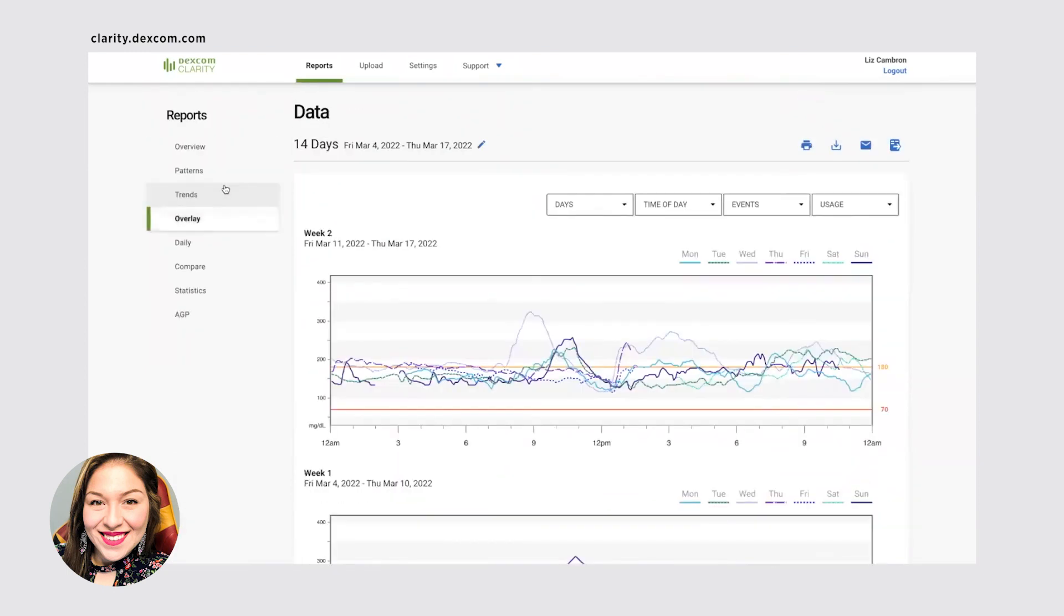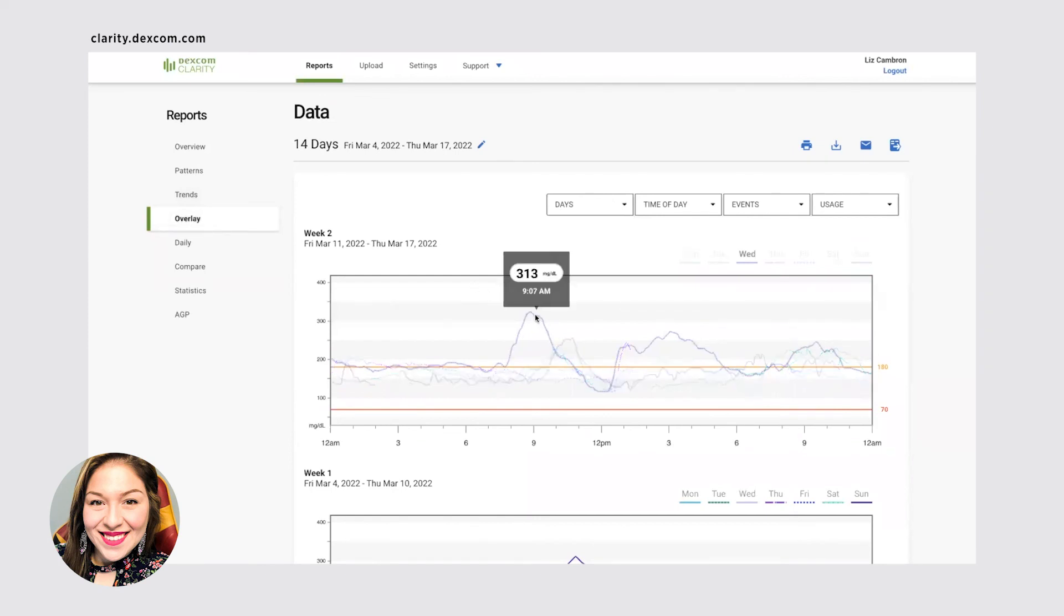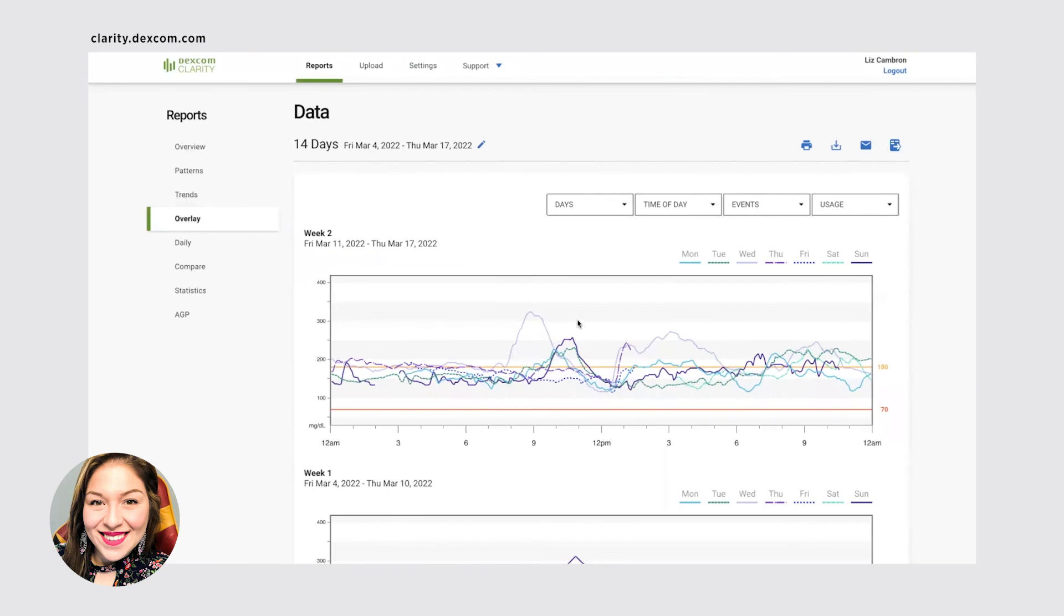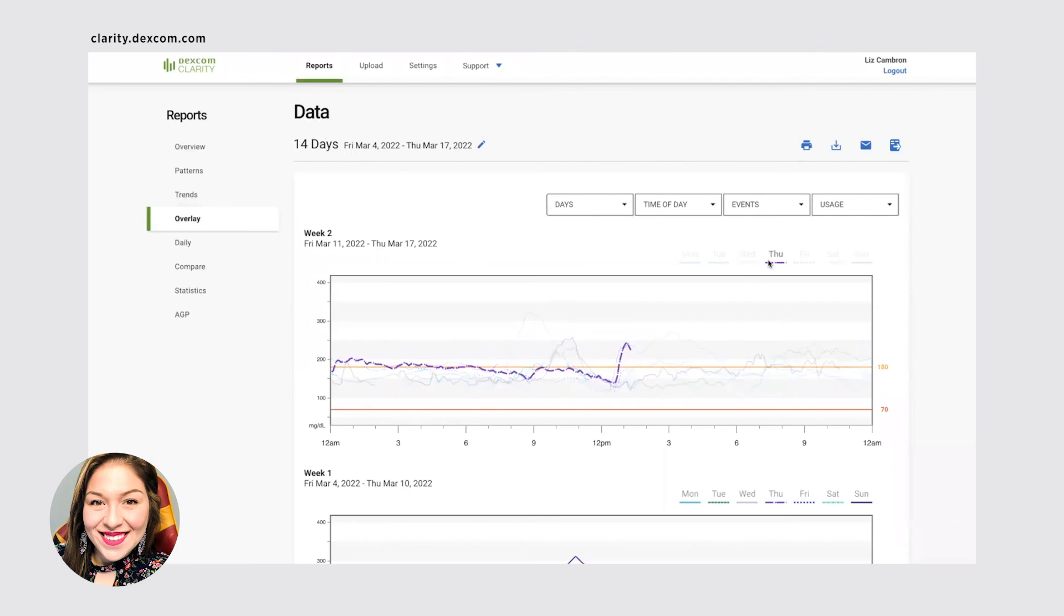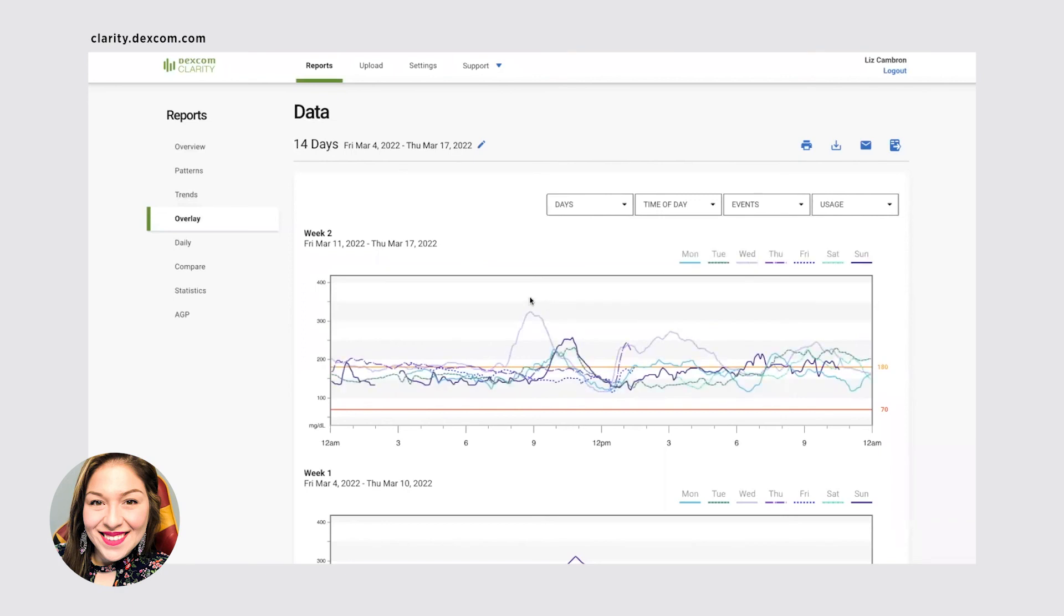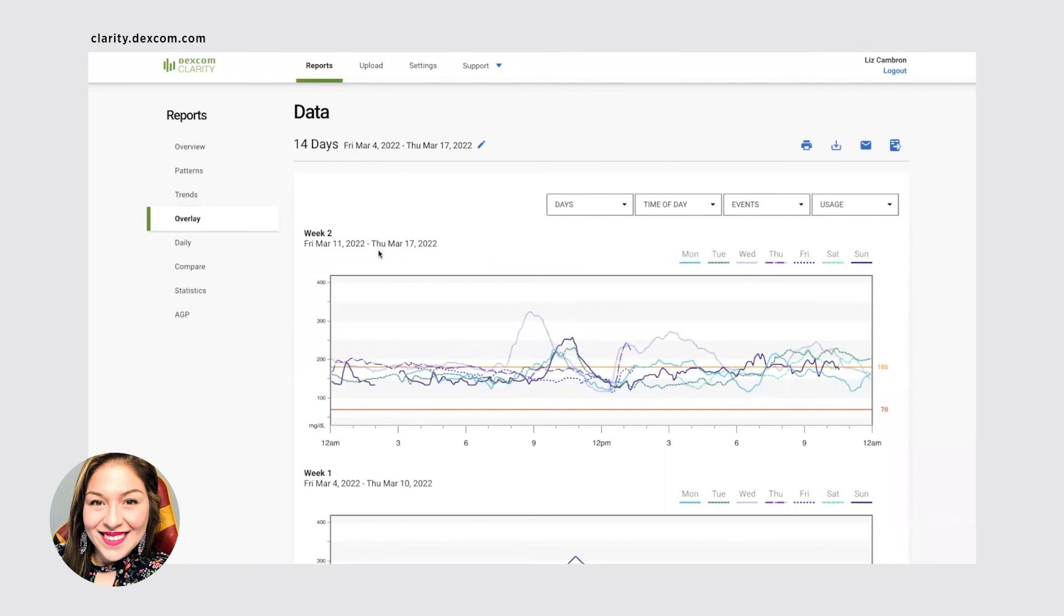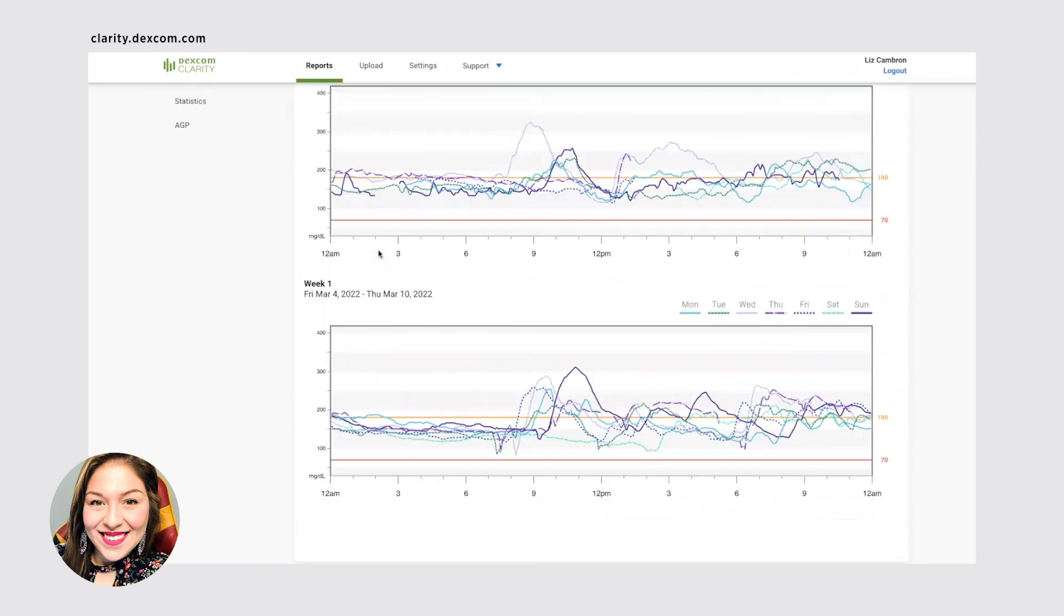You can also look, if you want to really look into the individual data, you can look at the overlay. So it shows you each individual day color-coded here. So you can look at all your days together, but if you only want to look at one day, you can do that too.